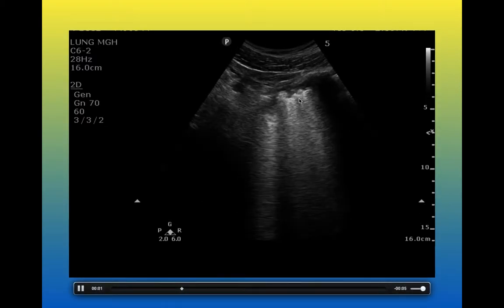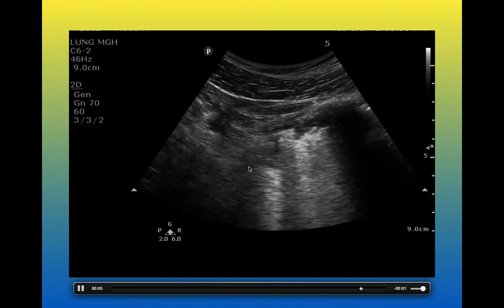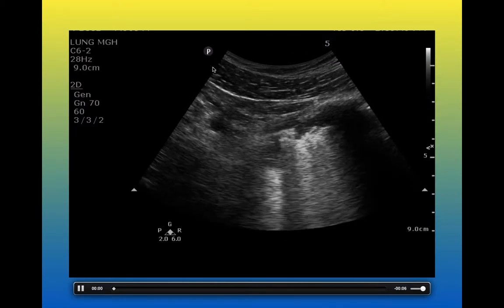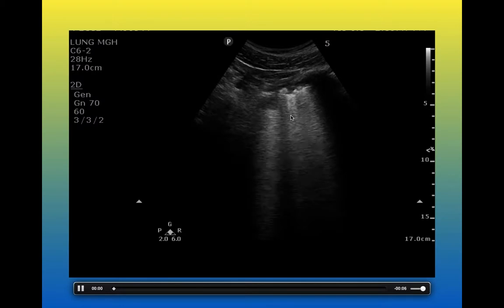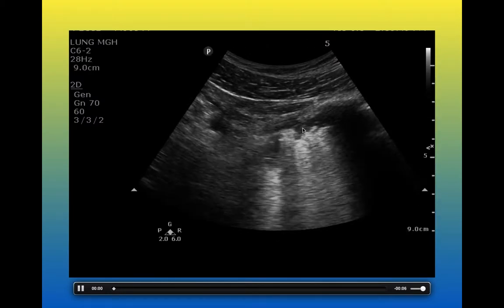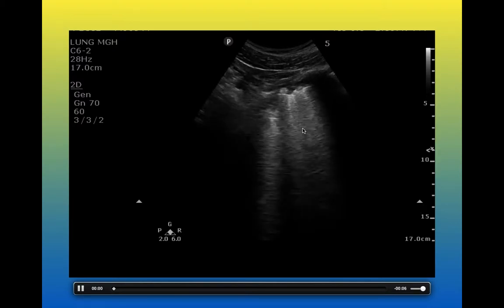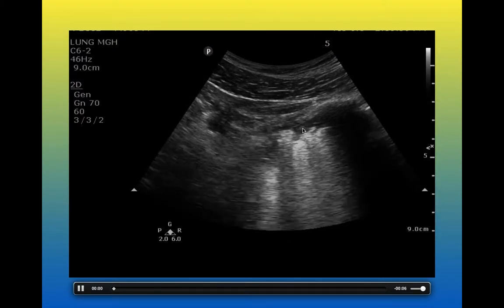Zone 5, this is no mystery. Again, abnormal pleural line, pleural border. So we're seeing it both now on the right, or now on the left. Before it was all on the right side. So this is a diffuse bi-pneumonic or lobar process on both sides of the thorax.